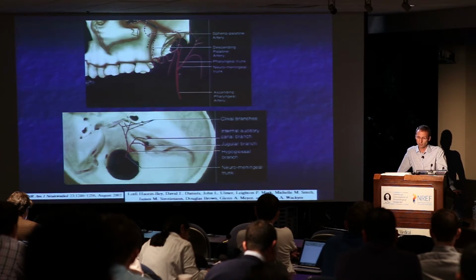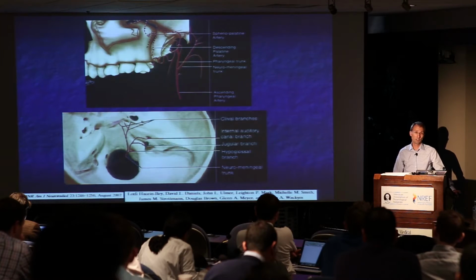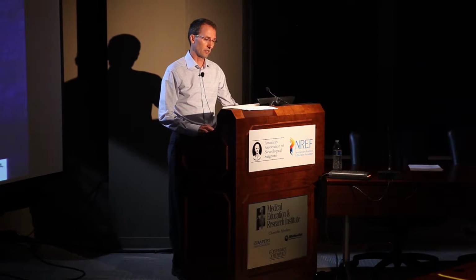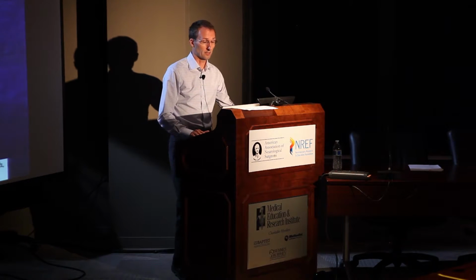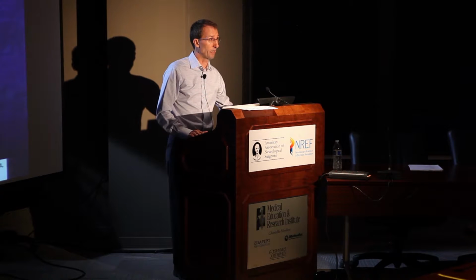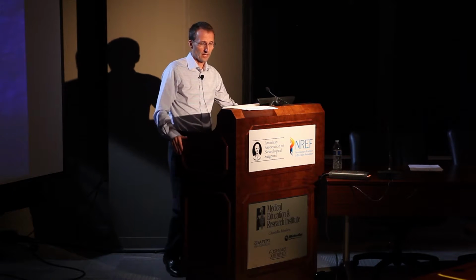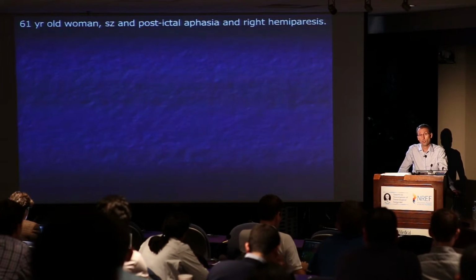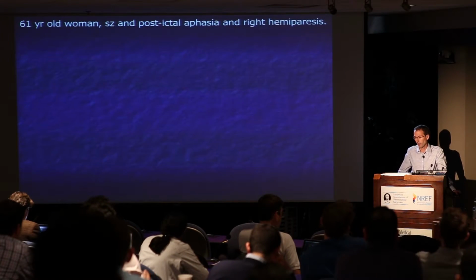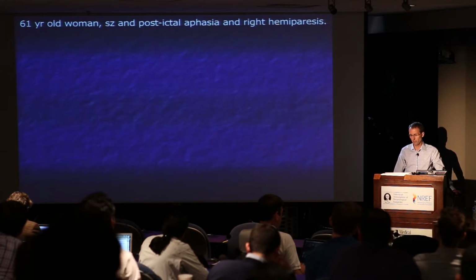And if you're embolizing with Onyx in and along the ascending pharyngeal, particularly in the neuromeningeal trunk, there is a real risk of cranial neuropathy that's not going to improve. So I find these as big red flags, and I personally am very cautious about any transarterial embolization in their territories. Okay. Let's go through 2 or 3 cases, because again, I want to focus mostly on anatomy, but let's start with this one.